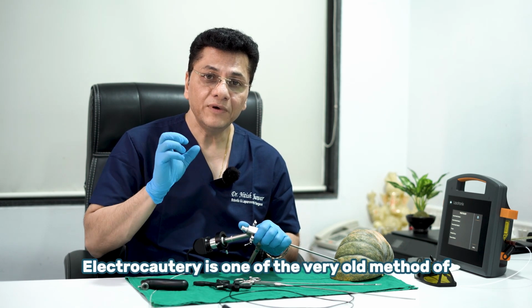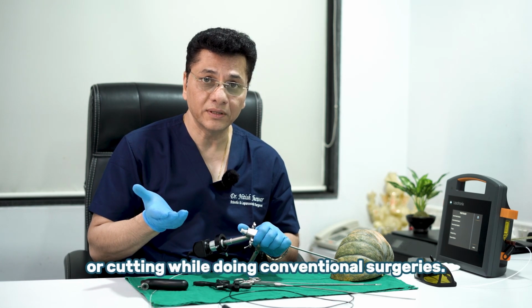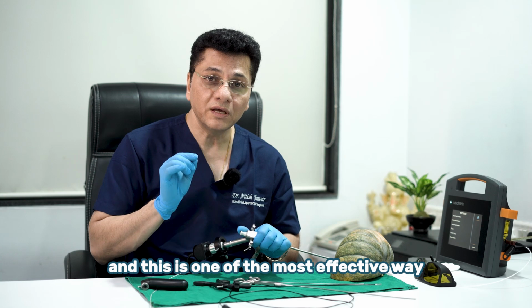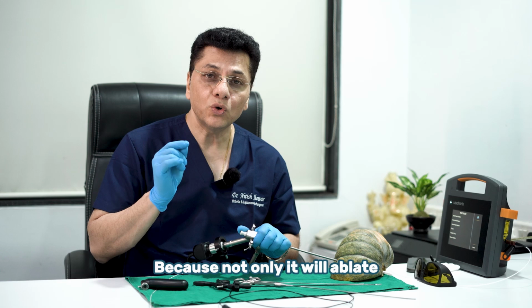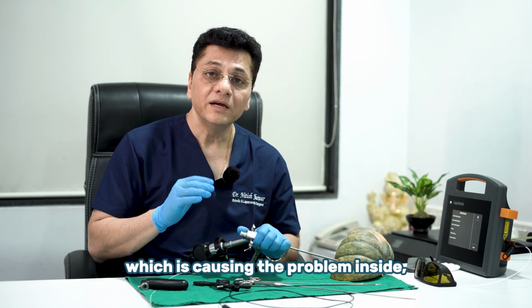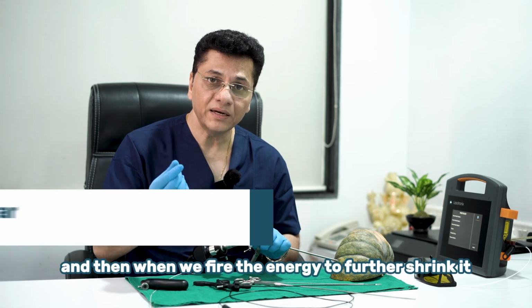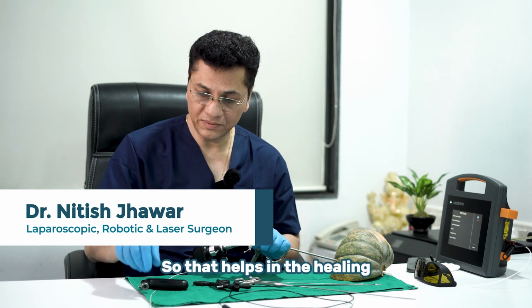We are talking about the advanced procedure. Electrocautery is one of the very old methods of coagulating or removing tissue or cutting while doing conventional surgeries. The laser is the latest kid on the block, and this is one of the most effective ways of treating fistulous tracts and pilonidal sinuses, because not only will it ablate the granulation tissue which is causing the problem inside, it will also shrink the tract. So if we are using a wide tract, when we fire the energy, it will further shrink it, and that will hasten the healing. So that helps in the healing.